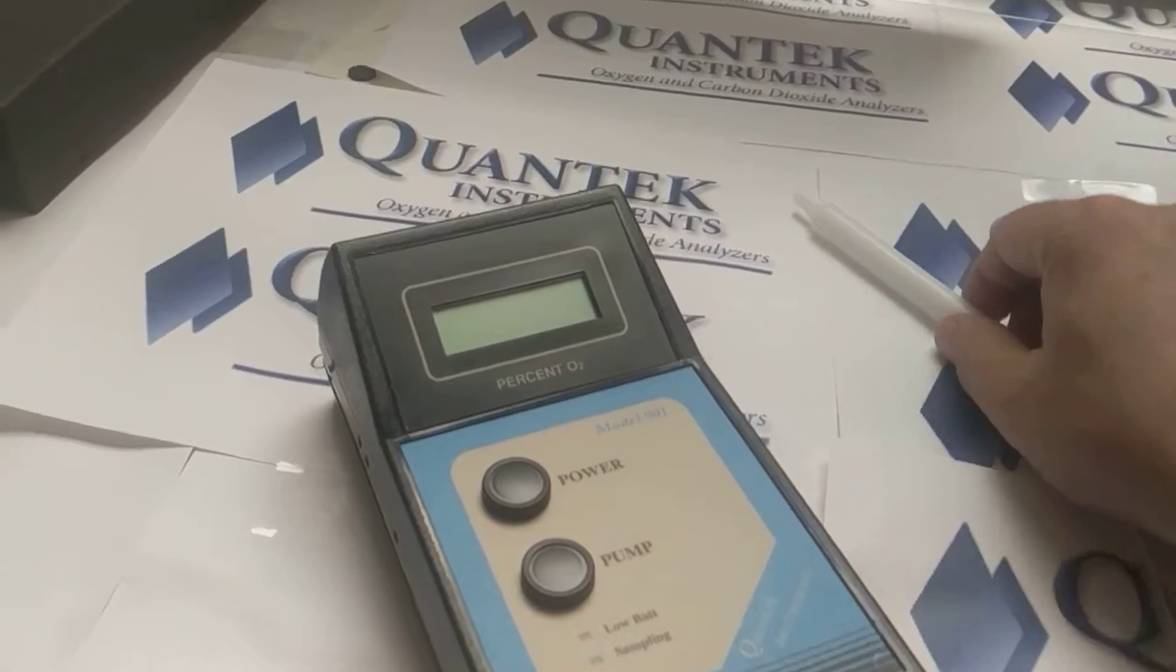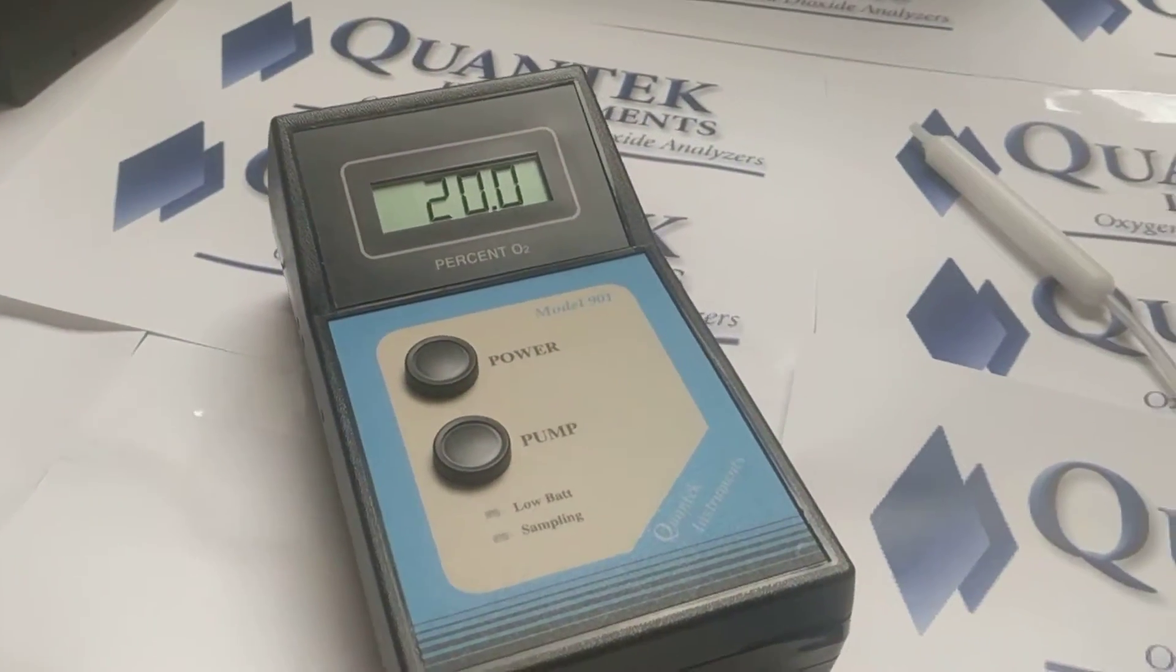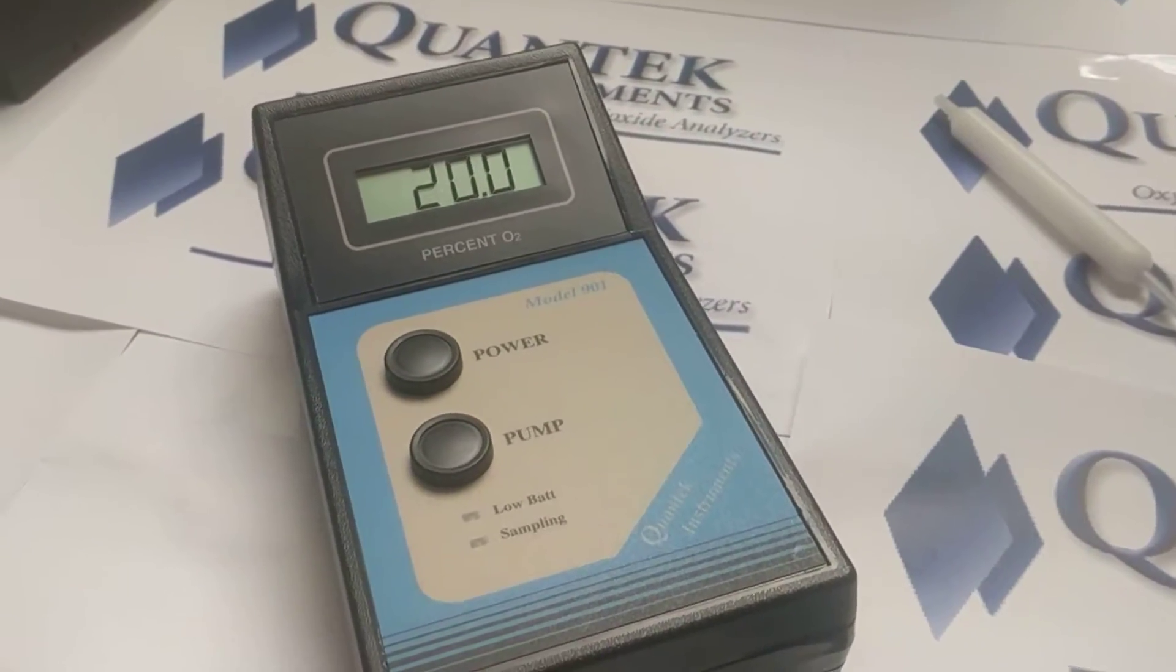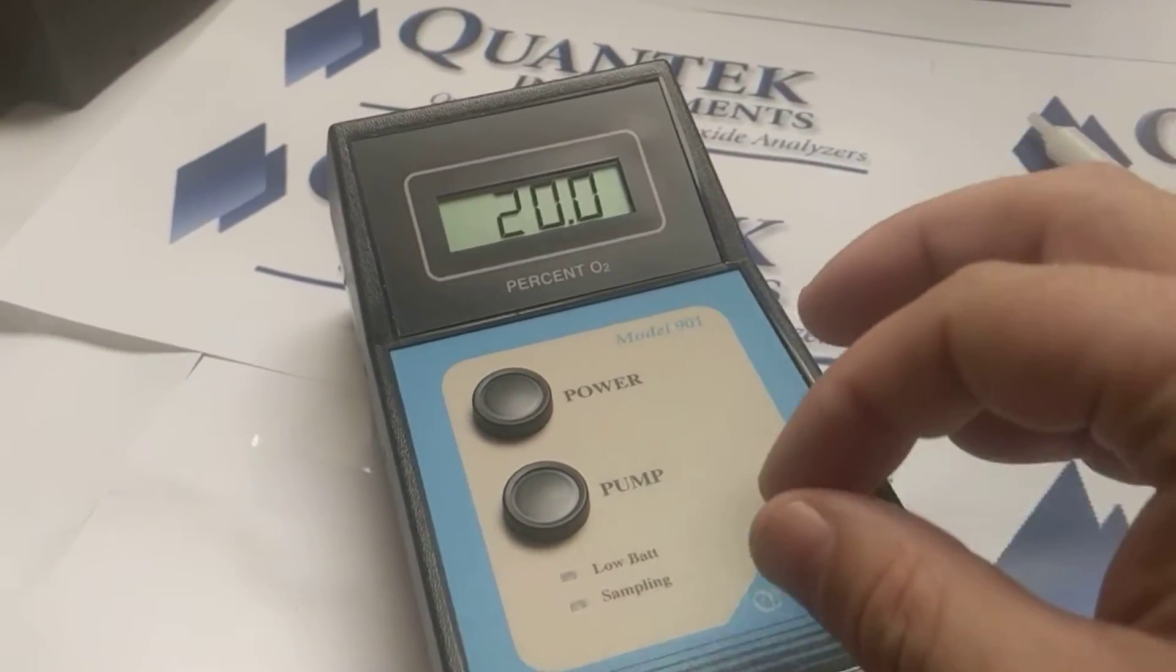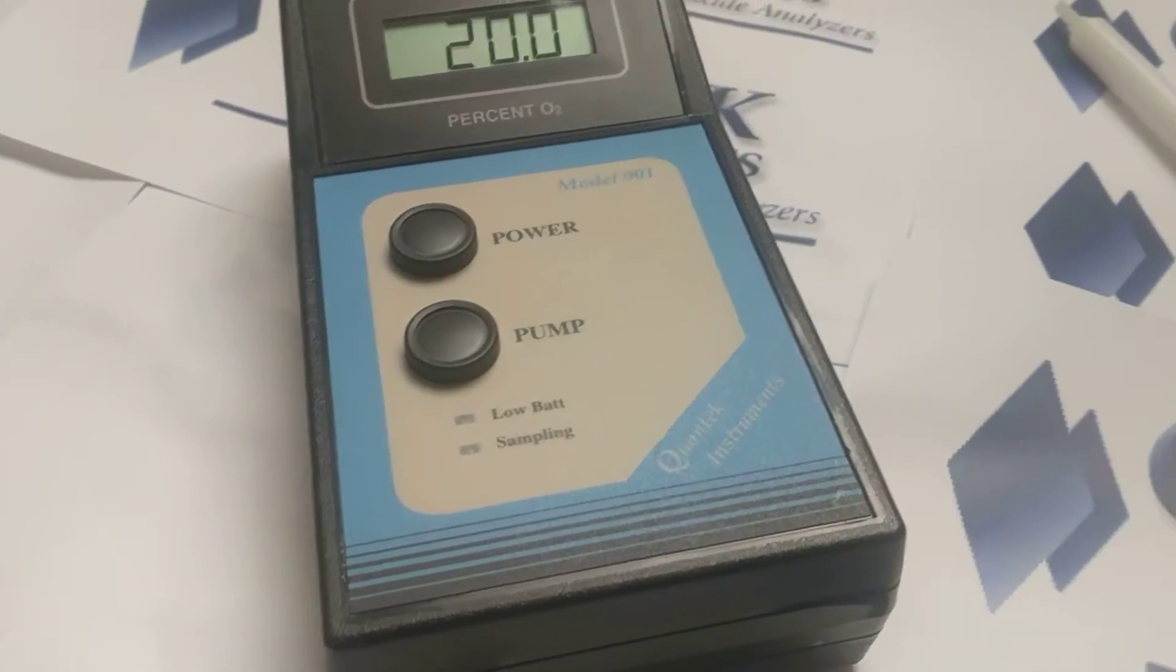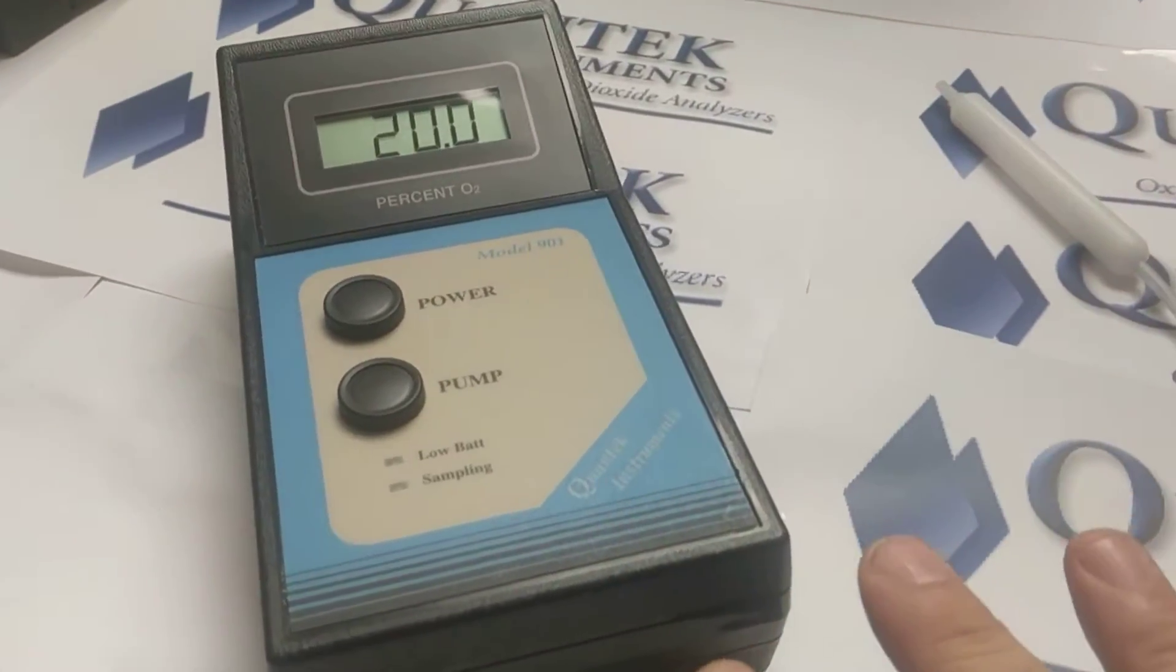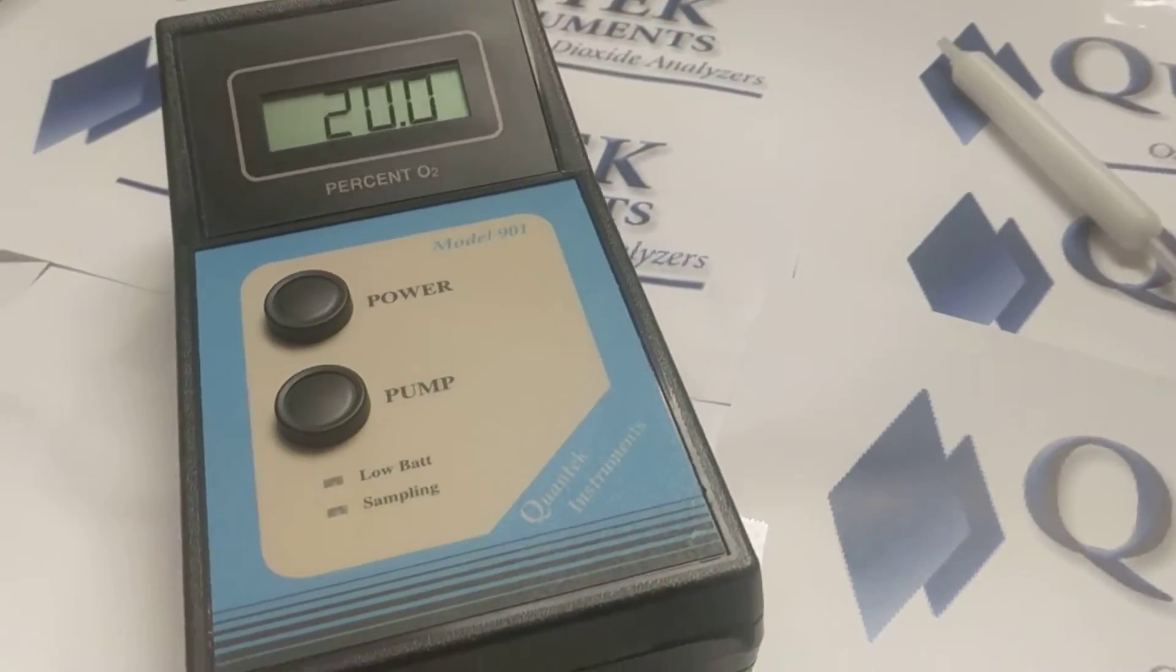So the first step is we're going to power the instrument on, and you're going to notice something when it powers on. It reads 20.0. This is normal as the sensor will consume a tiny amount of the oxygen that is in the sensor, and when the instrument is left idle, whether it's on or off, that reading will drift down.